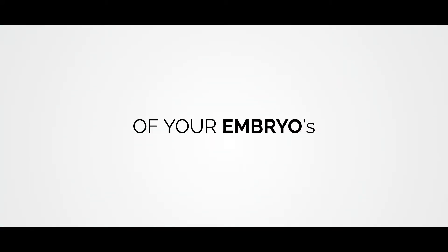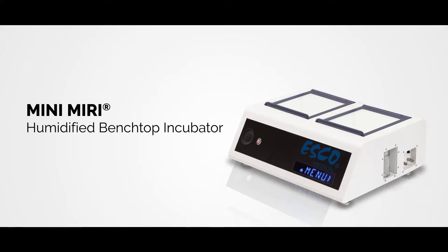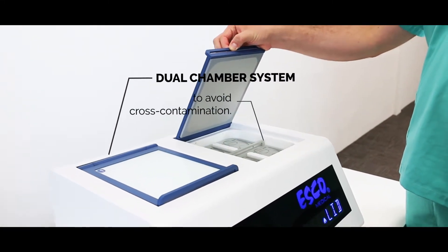Secure the development of your embryos with the new MiniMiri Humidified Benchtop Incubator. The MiniMiri has a dual chamber system to avoid cross-contamination.